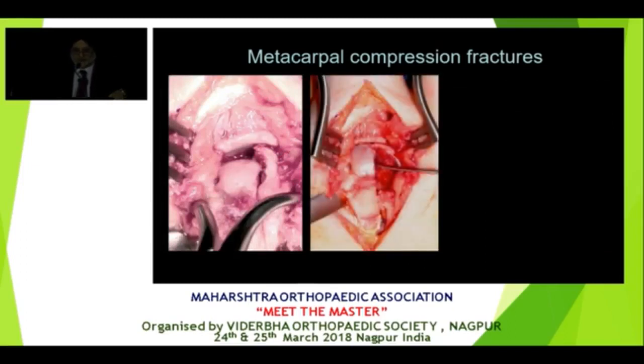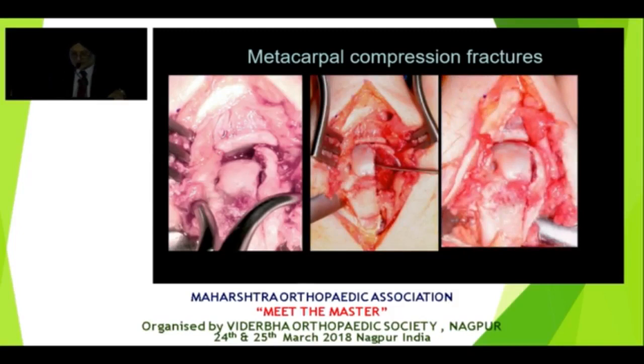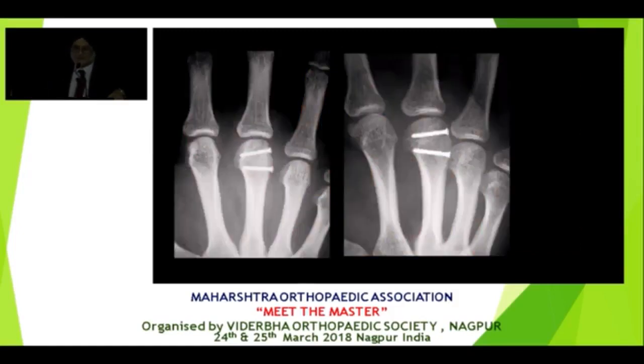put a Freer elevator, pick up the bone like a ping pong ball, pick it up, close it back and put lag screws across. And that's what it looks like. So a lot of these fractures are very simple. You just understand the fracture pattern and you treat it.